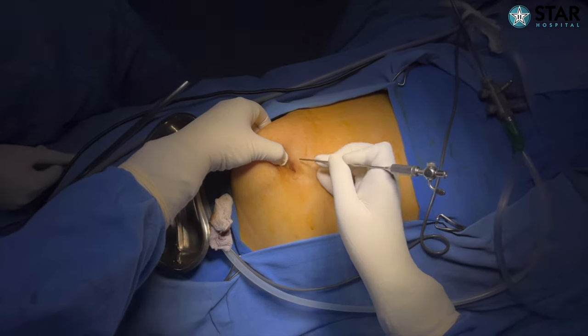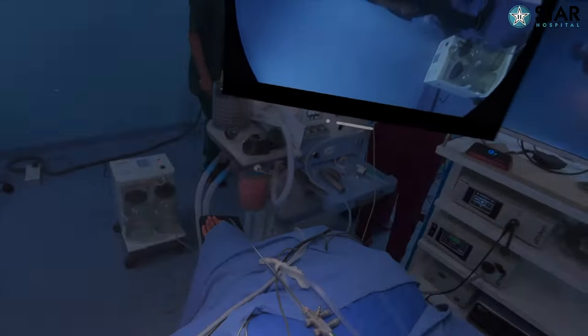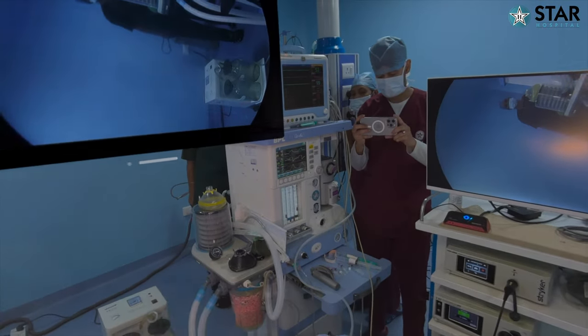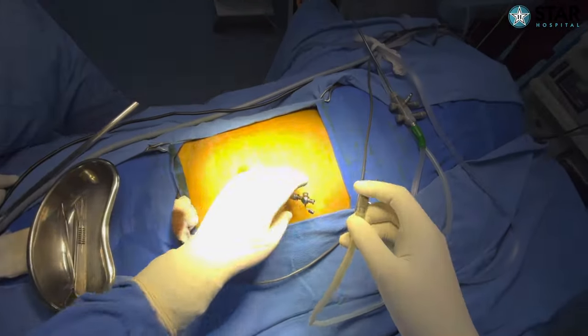I'm going to create the pneumoperitoneum now. I can see the instruments — the insufflator is right across from me — so I can keep my monitor on one side, see the insufflator, and start insufflating.